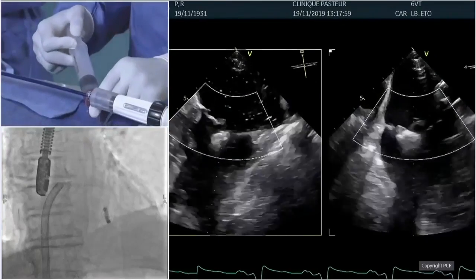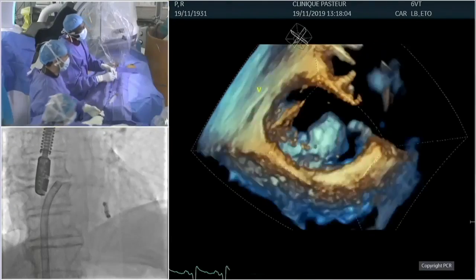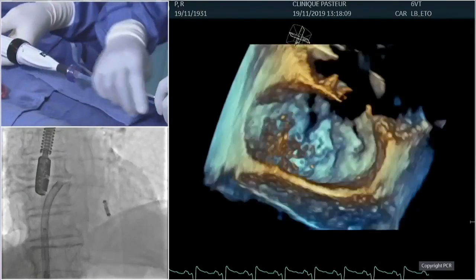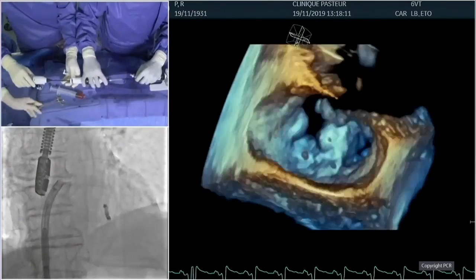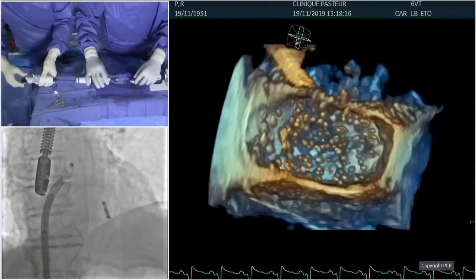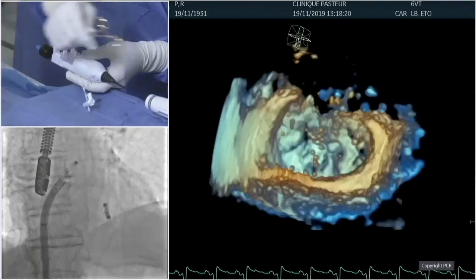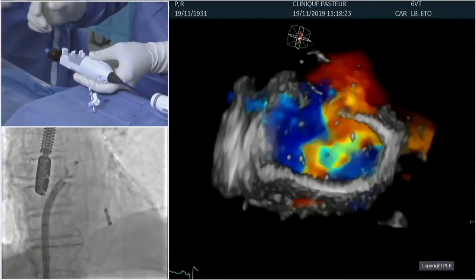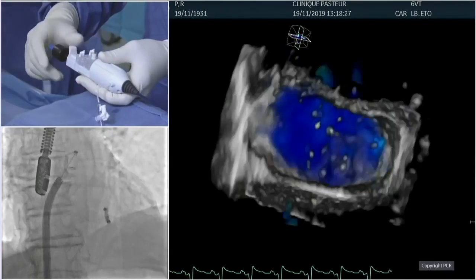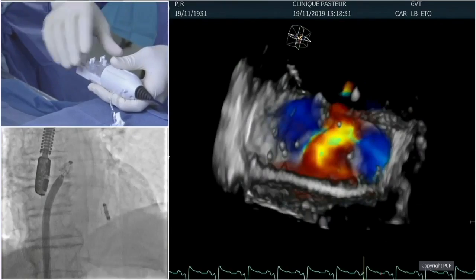In the flail leaflet, it's very hard to grab. So if you aim for the flail, you've got to come with some procedure. Maybe if you need a second clasp anyway, it's easier to start a little bit medial or lateral and then have a nice and easier clasp and then go for the second clasp right after. Holger, any rules? Start medial, go lateral with the second, or start opposite? What's the recommendation? Normally, you have to go more medial with the first Clasp PASCAL, and then with the second to the lateral. Yeah, it's the better way to do.